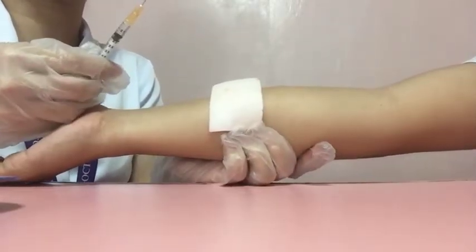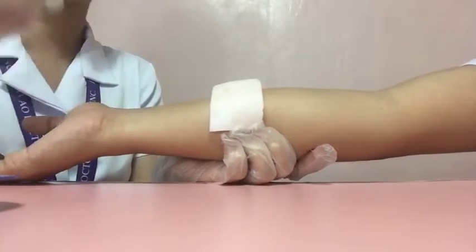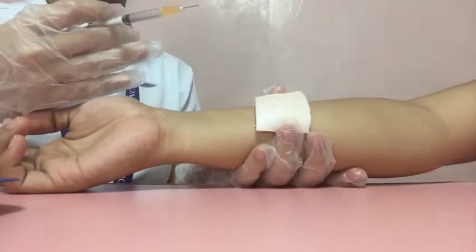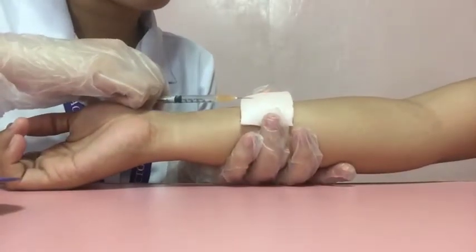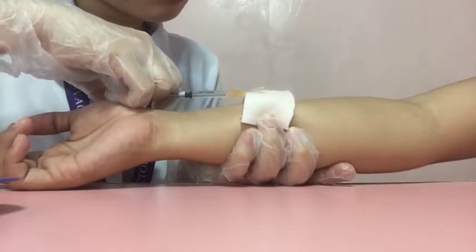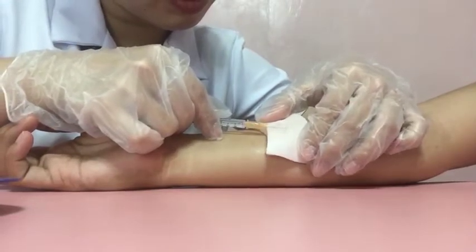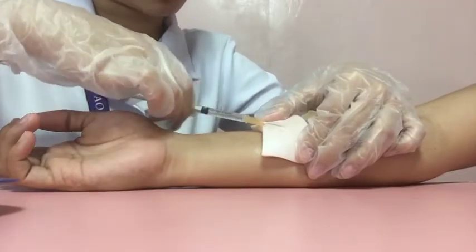So now let's insert the tip of the needle far enough to place the bevel through the epidermis into the dermis. So now inject the medication carefully and slowly so that it produces a small wheal on the skin. So this verifies that the medication enters the dermis. Ma'am, mag-inject ako ma'am ha. Medyo masakit na siya ma'am ha.